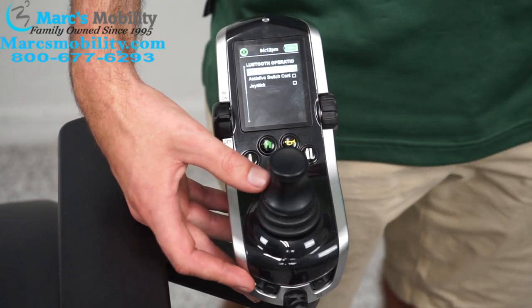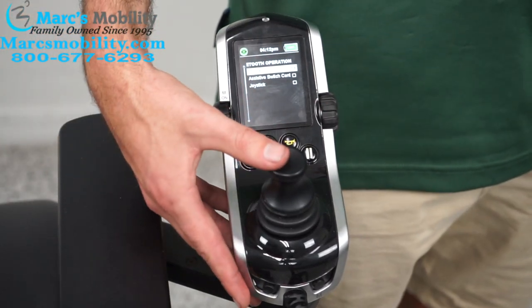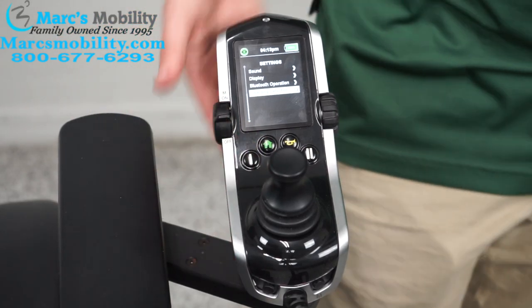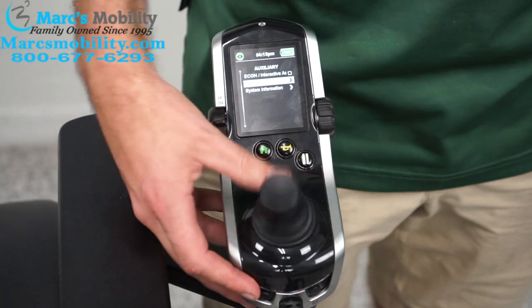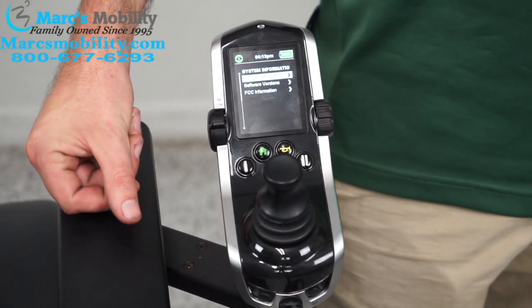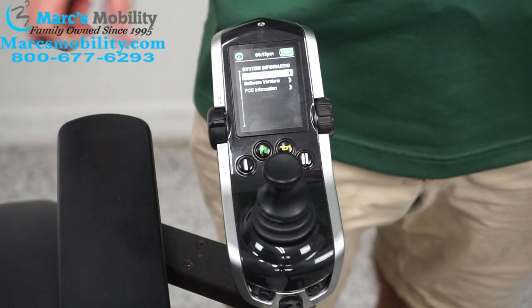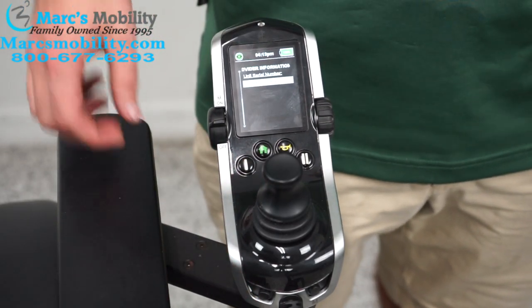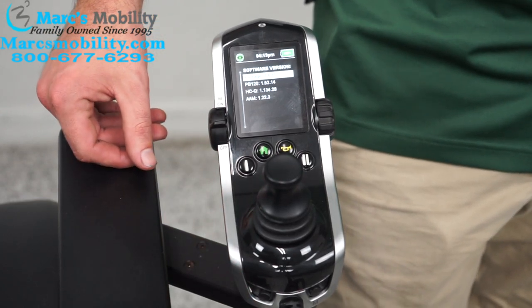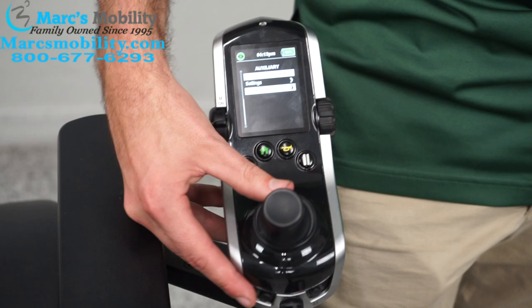Bluetooth operation lets you select which Bluetooth device to use by going right on the joystick. Charging detection enables the chair to detect when it's charging. Next is system information: if you want the serial number, instead of taking apart the shroud, go here to provider information and push right to see the serial number for the unit. Software version shows how up-to-date your software is with all version details. FCC information is also available there.